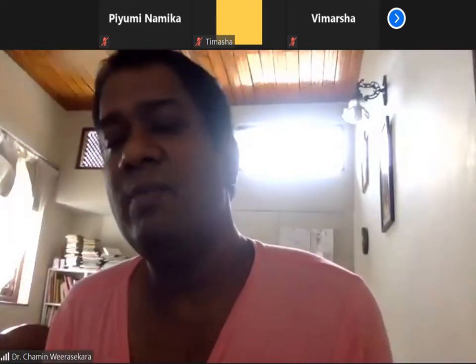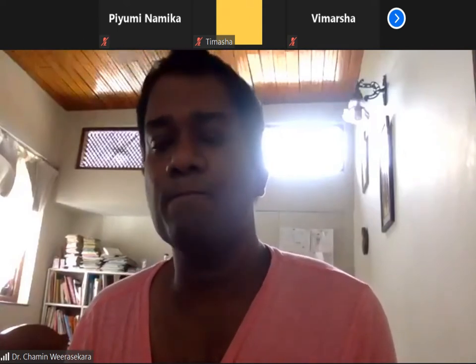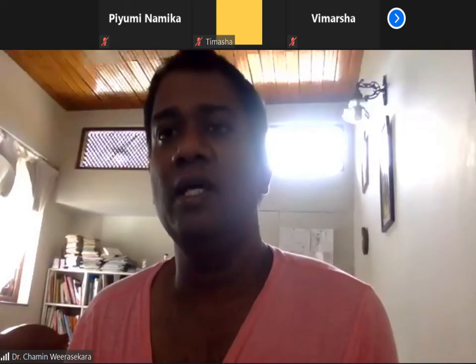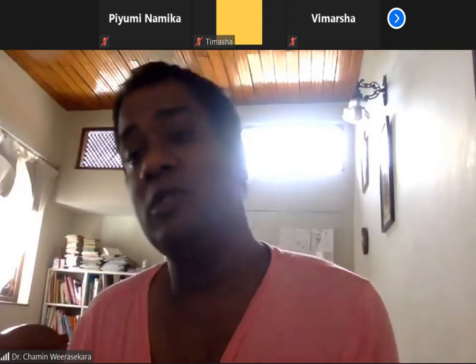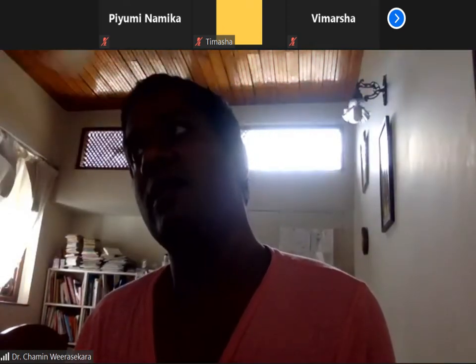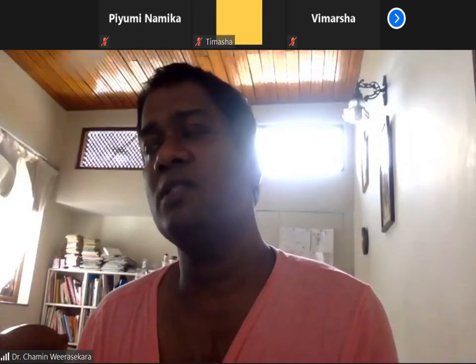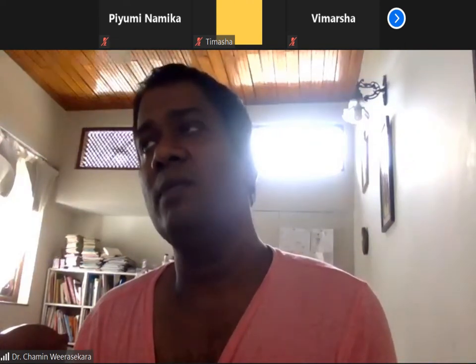Then ABG at PO2 100. එතකොට බලන්න ඕනේ මේ FiO2 එක කොච්චරද කියලා, the inspired concentration of oxygen. So if the PO2 is 100 with 21%, it's okay, isn't it? If the PO2 is 100 with 100% oxygen, it's not okay. So always check the inspired concentration of oxygen, or FiO2 කියලා ගහලා තියෙන්නේ. You must always check the inspired concentration of oxygen when you look at the partial pressure of oxygen.